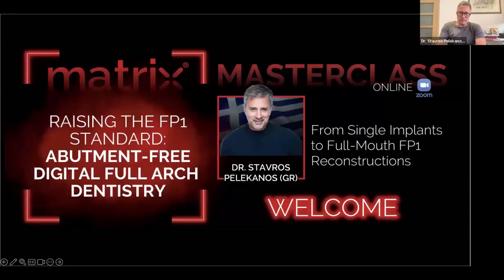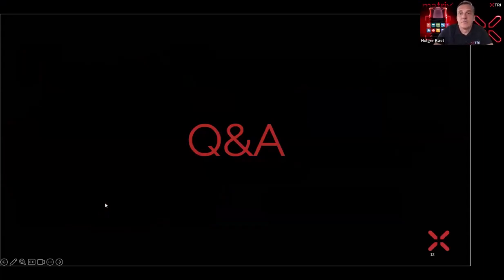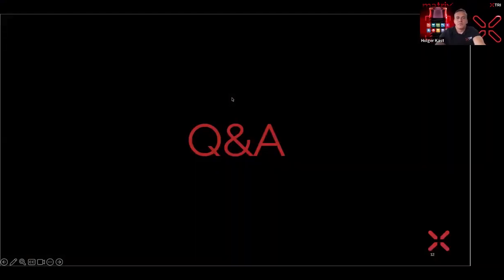It's any flowable composite, let's say, with high particles, needs to be also strong, but I don't remember now the name that we are using. Yeah, we just see that is the big advantage of this chemical bonding as well. And with this way of flex fit, we need to consider, as Stavros told, that we changed the 3D printed temporary to a final milled version later on.